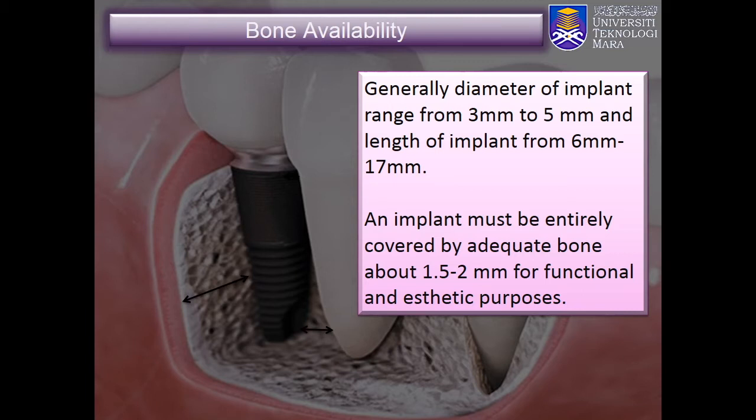The space envelope required will depend on the diameter and length of implant to be placed. This space requirement must be considered at both the intercrown to interroot level. Lack of bone availability will make the treatment more complex, expensive, and demanding for the patient, as additional procedures such as soft and hard tissue grafting will be required.